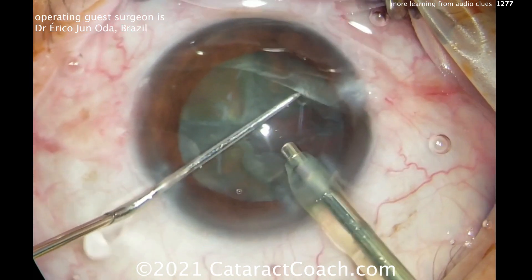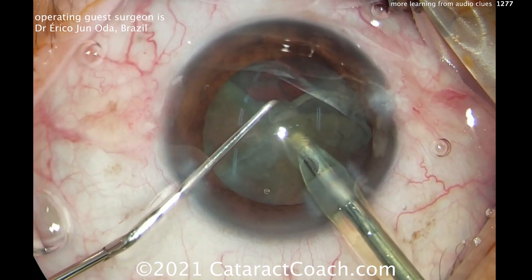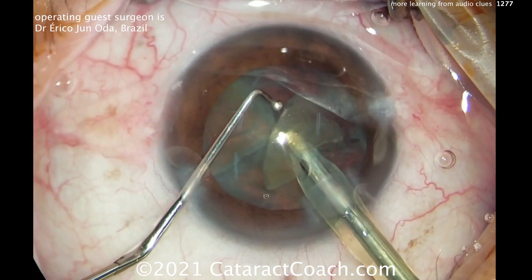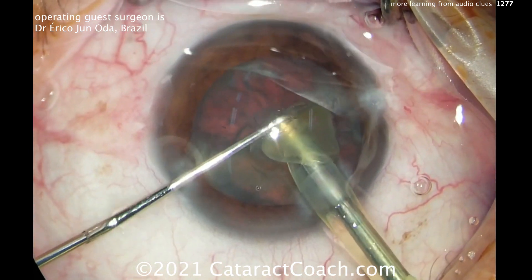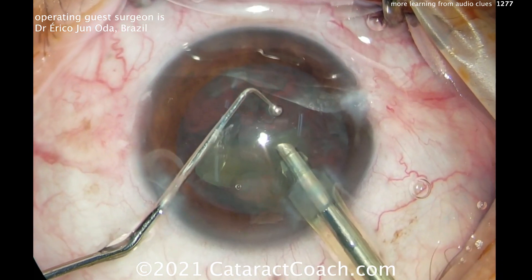The machines make slightly different sounds, but the concepts are similar. Now getting this quadrant up — that's high vacuum, and the 'eh, eh, eh' means occlusion. You can hear the rattling of the FACO because he's using some good FACO power modulations. The nucleus removal is pretty easy, pretty straightforward — comes out pretty nicely.